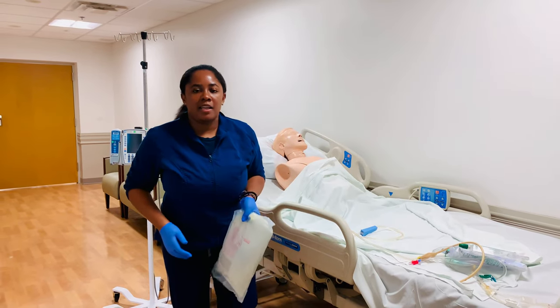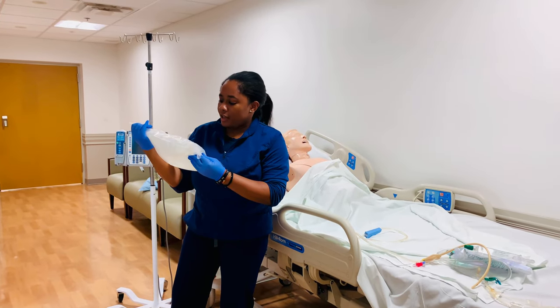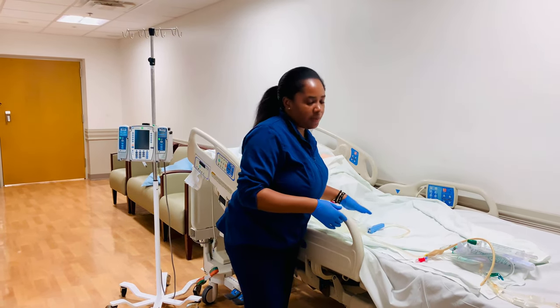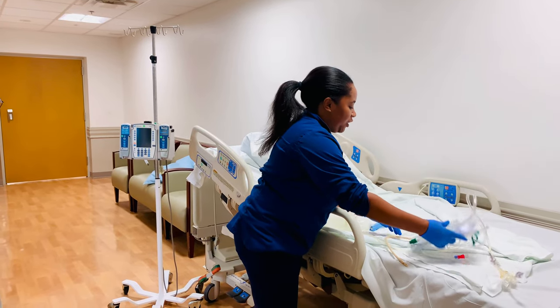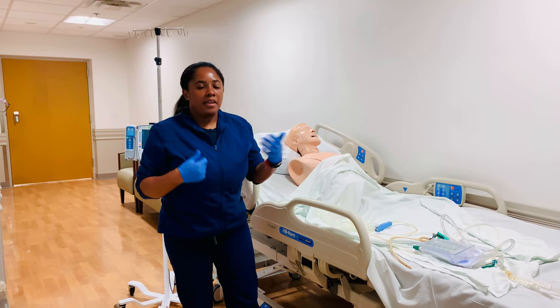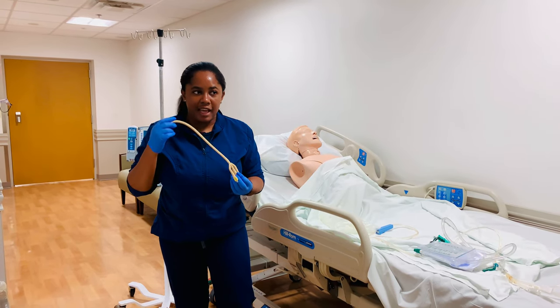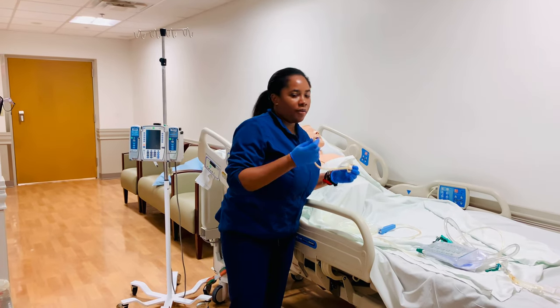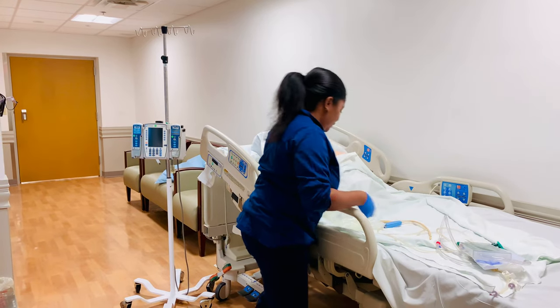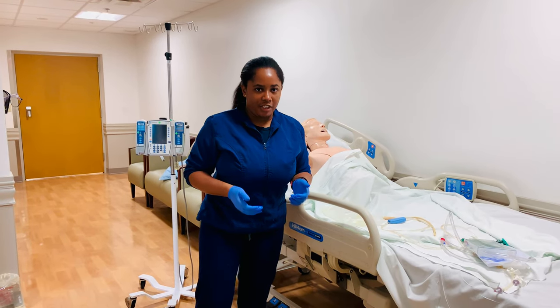For continuous bladder irrigation, it's not going to be your typical 1,000cc saline bag — we're going to be using a much bigger bag. This one comes in a 3,000cc, which is what most hospitals use. Also, patients will typically come from the OR with the Foley already in place, but if not, make sure the type of Foley you get is a three-way Foley catheter, in the correct French size. You'll also have your Foley bag and gloves.